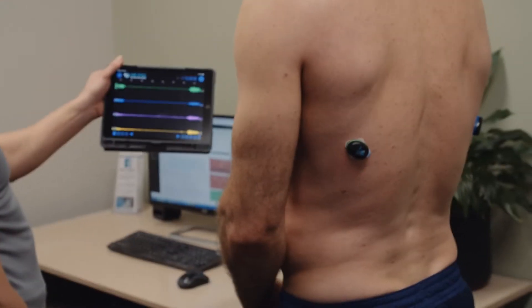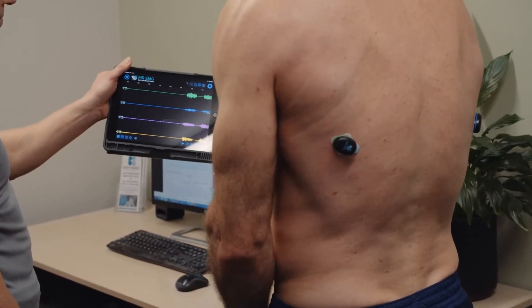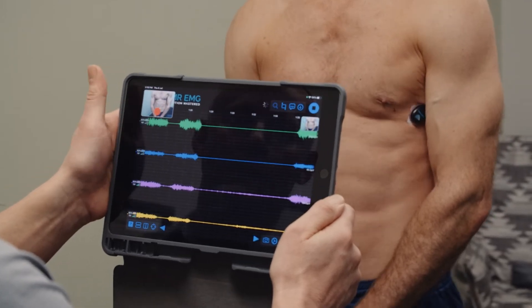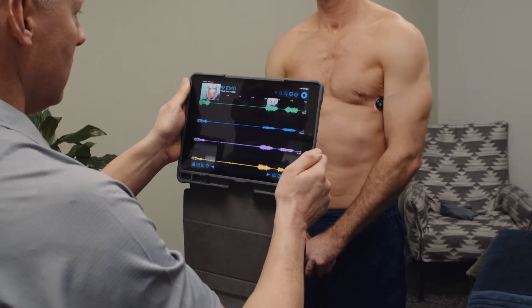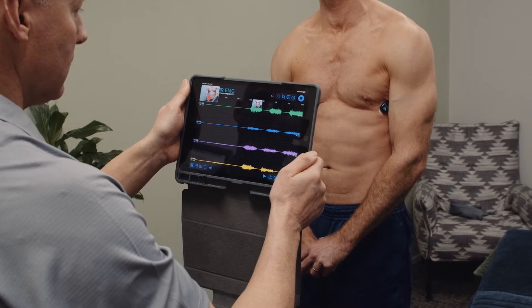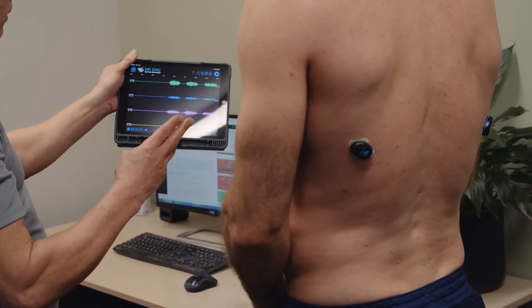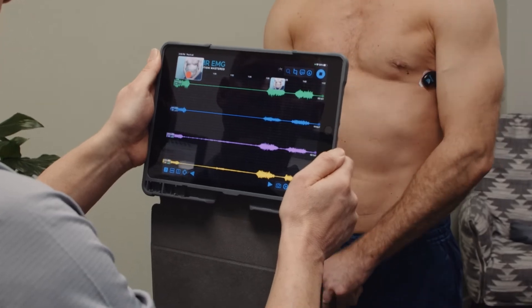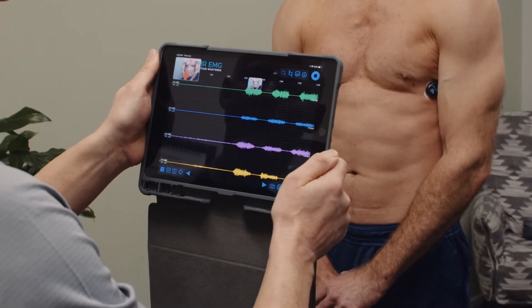Show your subject how to perform a maximal voluntary contraction of the serratus anterior muscles, with them standing and squeezing their shoulders forward and down. Then record your subject performing three maximal voluntary contractions of the serratus anterior muscles simultaneously. Ensure you take a picture of each activity so you have an image to match your data.